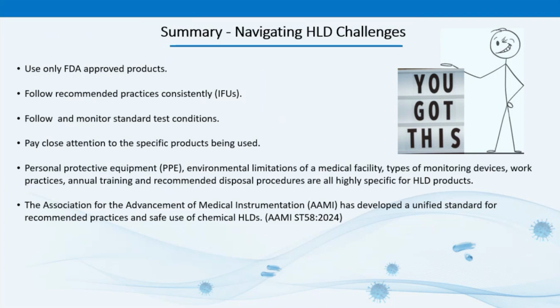Even small deviations from the process can lead to microorganisms surviving and an increased risk of infection. And no healthcare professional wants to be responsible for that. High-level disinfection requires as much diligence and attention to detail as sterilization. It's a complex process. HLD performed correctly can result in devices safe for patient use. A well-planned and managed quality monitoring program is a major part of ensuring the process is safe for patients.